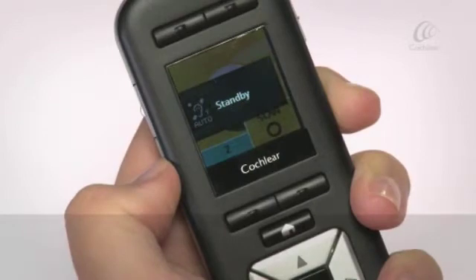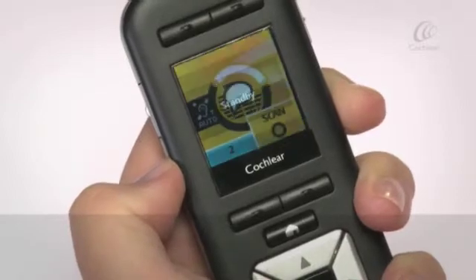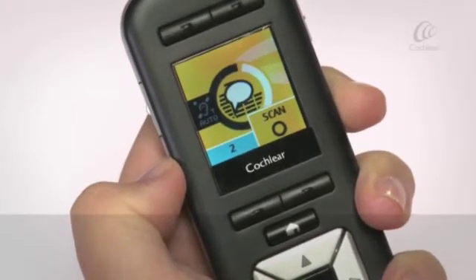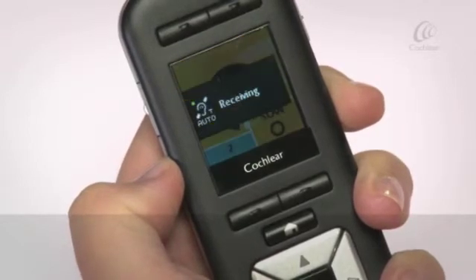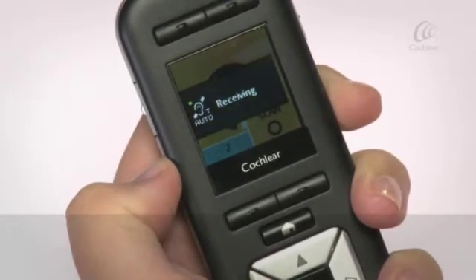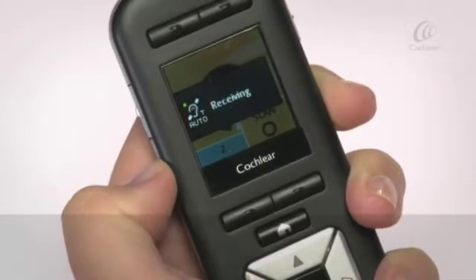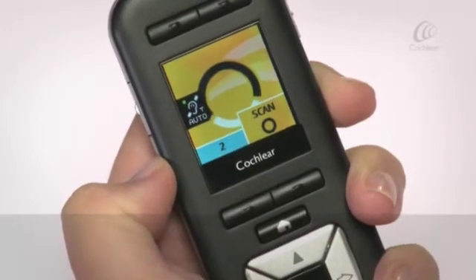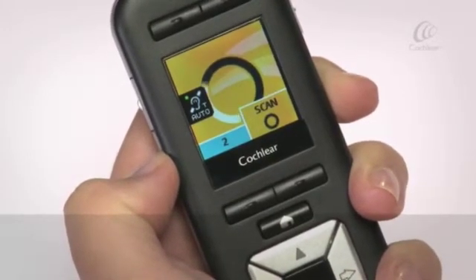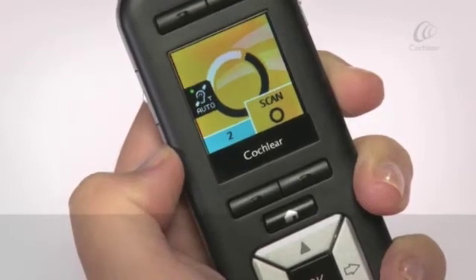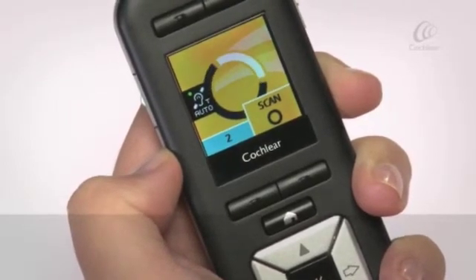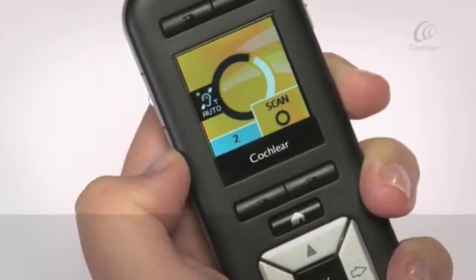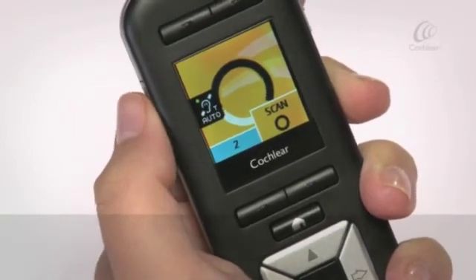Auto telecoil on standby: auto telecoil is on but your processor is not detecting a hearing loop or telephone. Auto telecoil on receiving: auto telecoil is on and your processor is in range of and detecting a hearing loop or telephone. The telecoil or auto telecoil off icon will briefly display on the screen when you turn off telecoil or auto telecoil.